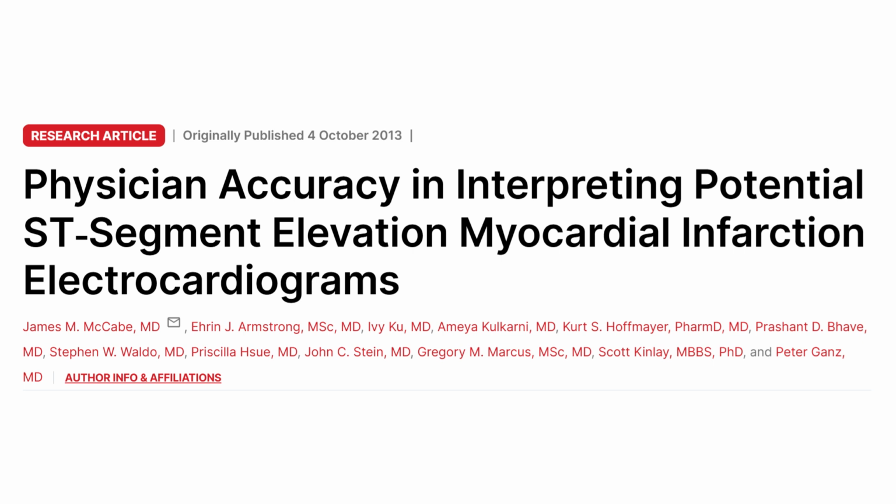And as this article from the Journal of American Heart Association points out, the interpretation of an EKG is largely dependent on the interpreter. They also point out that the sensitivity for picking up STEMI based on an EKG is only 65% and the specificity only 79%. That being said, EKGs are cheap and they don't impart any direct harm to the patient, so don't let any concerns about their inaccuracies dissuade you from ordering them.